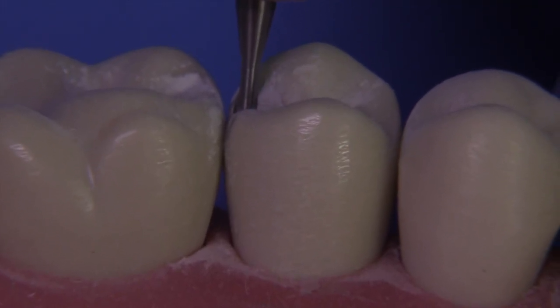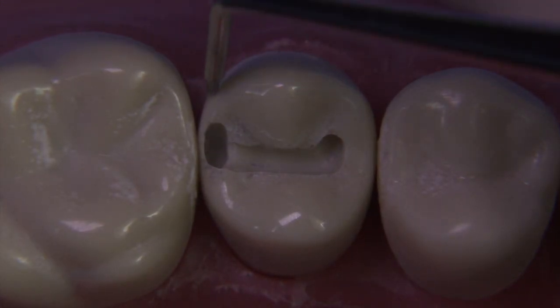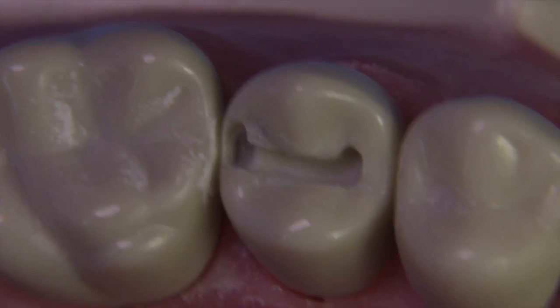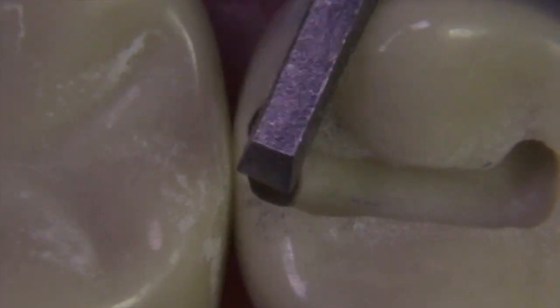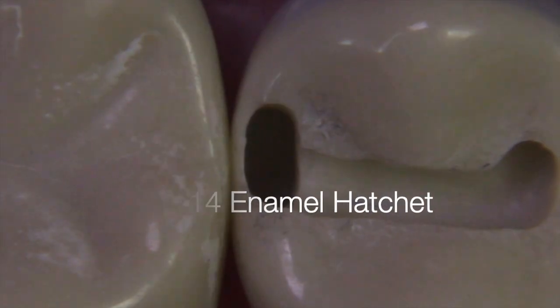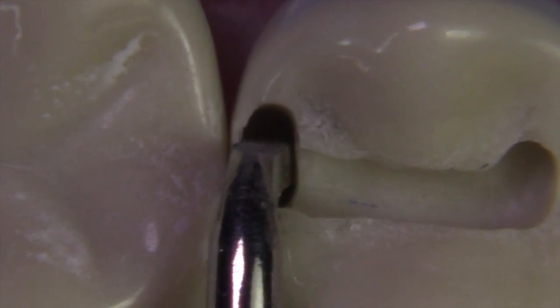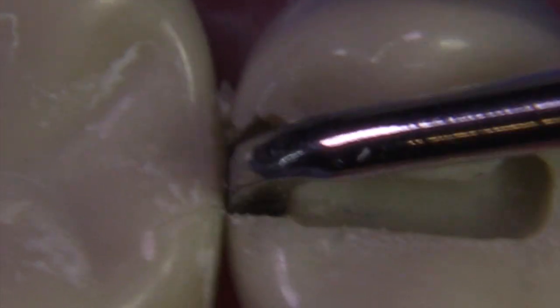It's nice to hold the burr along the side of the tooth to get an idea of just how far you have to go. You can see that there's a small break down there at the internal — we've broken contact at the gingival. That's the indication to use the hatchet and break that away. I like to refer to this as the Sturdivant chip, where you just rock the hatchet mesiodistally and knock off that little piece. Then we sharpen up the walls to create them at a 90-degree exit angle, using the instrument in a chopping down motion.